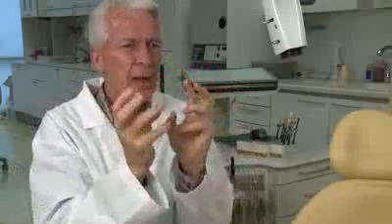Well, the challenge when Vit-l-escence came out, and Vit-l-escence truly, the first aesthetic composite of multiple shades, standalone dentin shades, standalone enamel shades, a complete palette of the making of a Michelangelo, if you will. How can we describe these varying enamel shades that are not just varying values, not just varying hues and chromas, but varying levels of translucency and opacity?